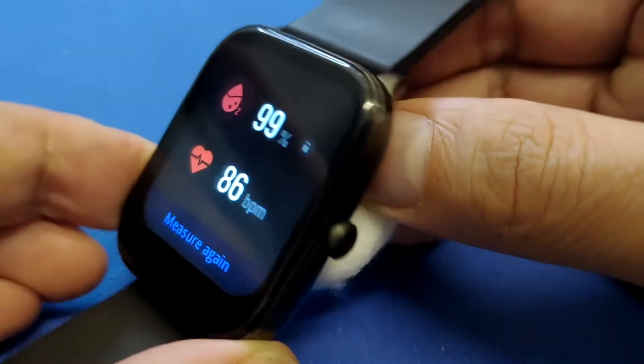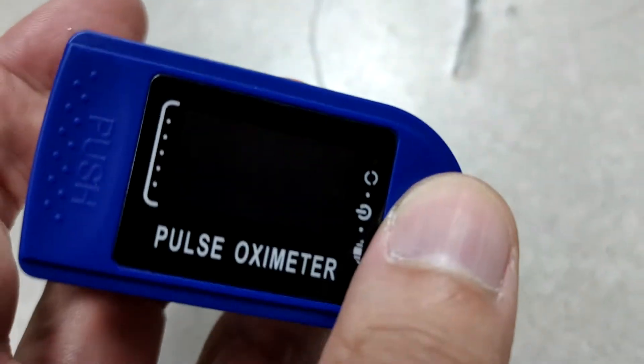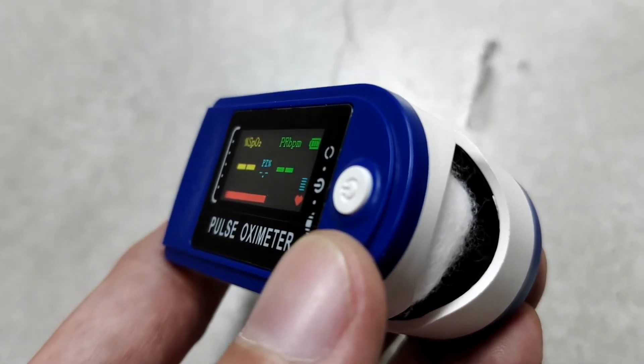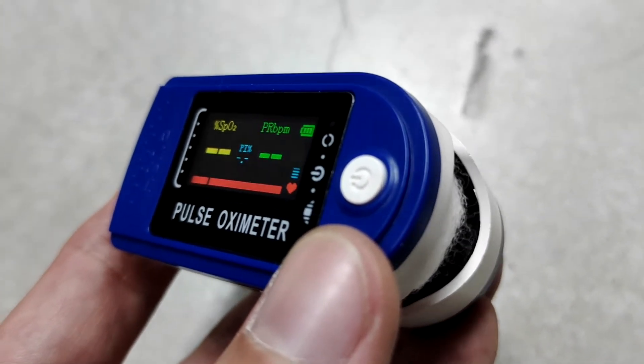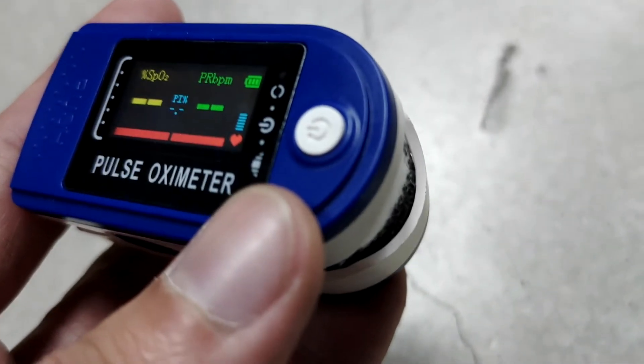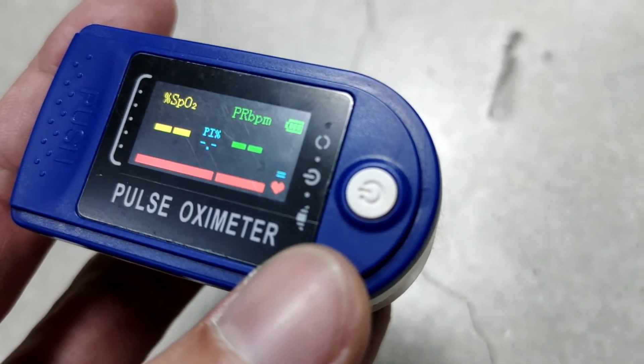Compared to the pulse oximeter — which has the same function — I'm going to put cotton inside the pulse oximeter to see if there's a result. It keeps reading and reading but doesn't give an oxygen level result. The difference is that the smartwatch uses reflective sensors, whereas the pulse oximeter has sensors on opposite sides of the finger.